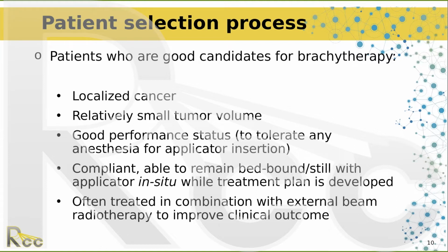Some of these treatments take an hour, not necessarily the treatment delivery, but the whole process. And that's a lot of time for a patient to be sitting around with an applicator. So you want them to have a good performance status and be compliant. And as we know, a lot of these are often treated in combination with external beam. Sometimes it's a brachytherapy boost after external beam radiation therapy or interleaved within the external beam.